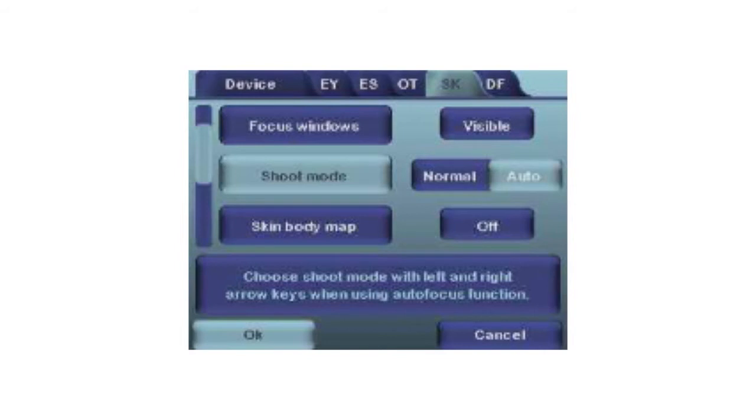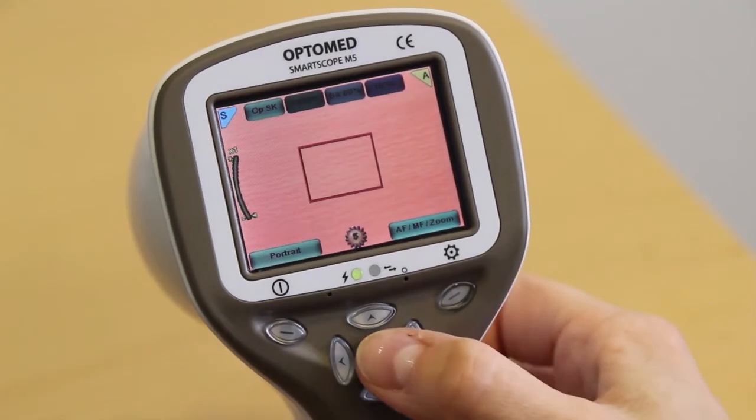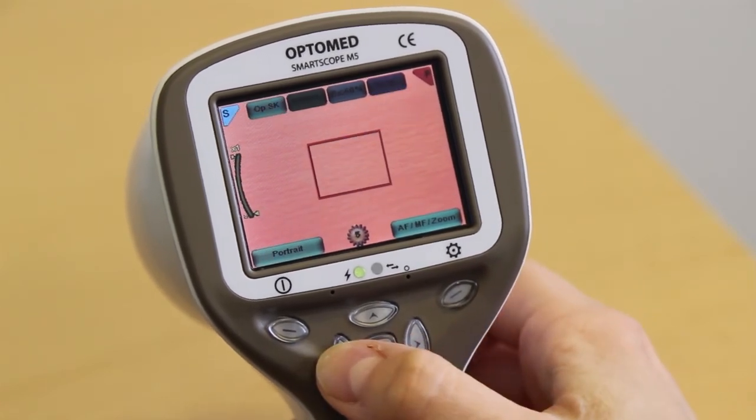With the auto shoot mode, you only need to press the button halfway down and the camera will focus automatically. Focus window: the focus window feature helps the user find the right focus target in the image. You can hide or enable the focus window in the SK menu. The focus window is activated by pressing the middle key until the icon F appears on the screen. Move the red focus window box by using the arrow keys.